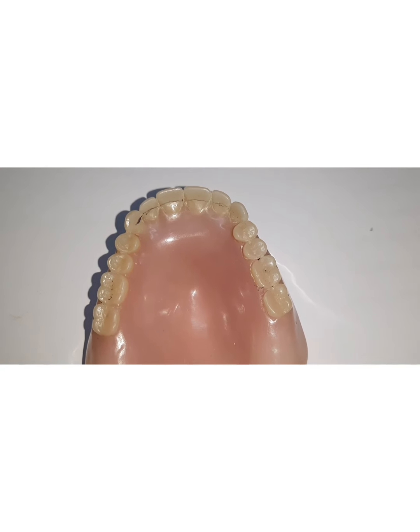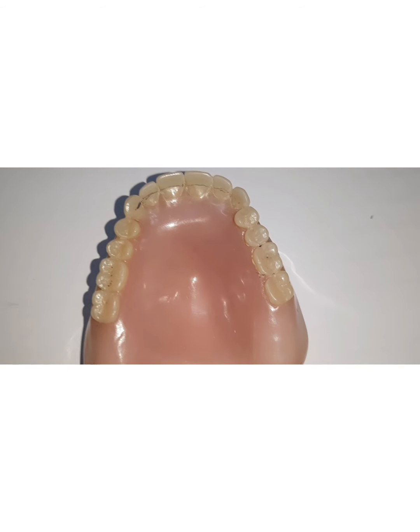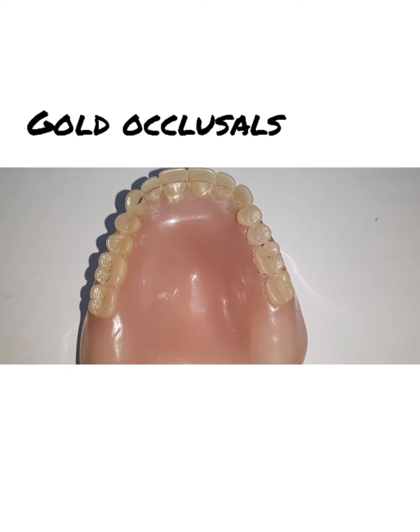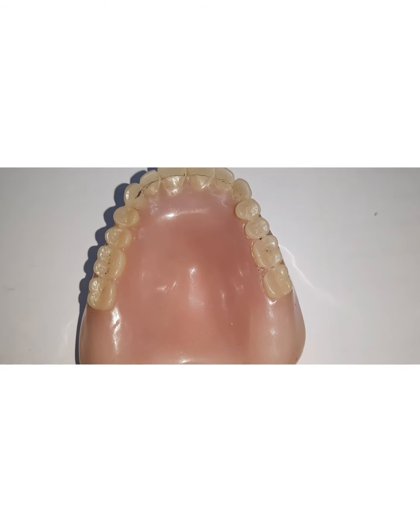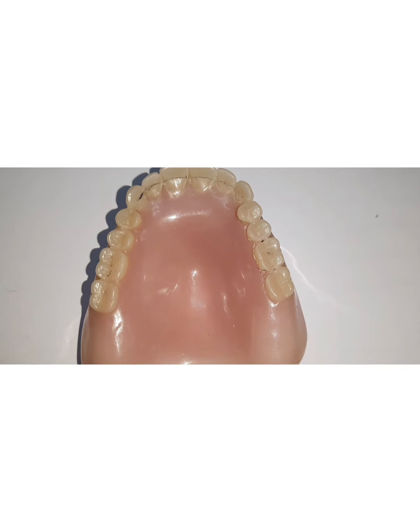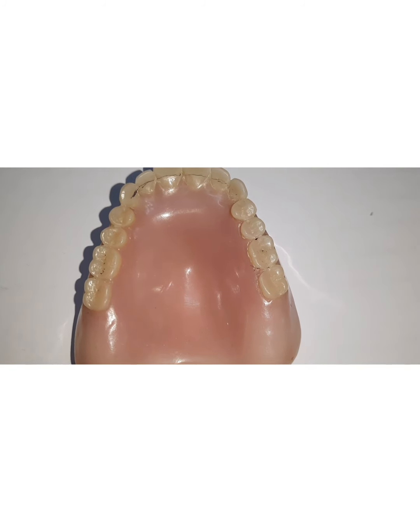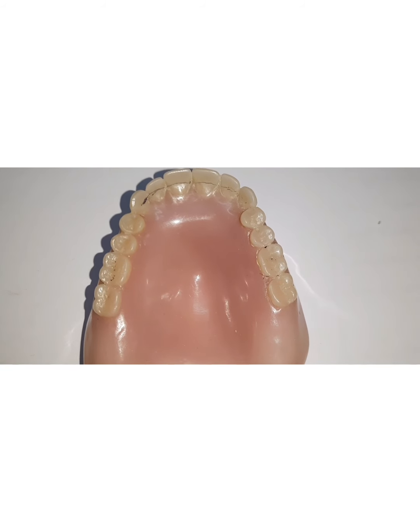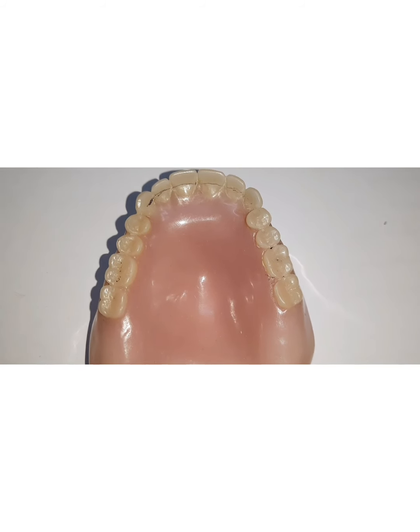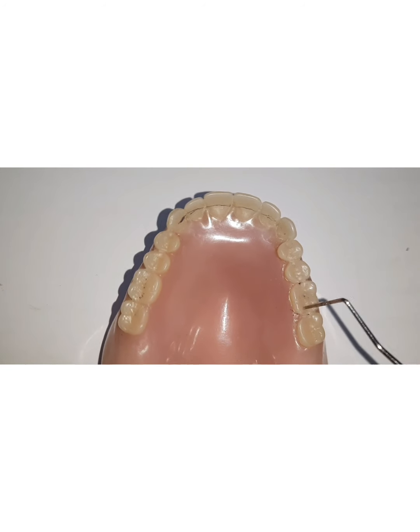Another type of teeth which can be used are the gold occlusals. Gold is considered the best material to oppose natural dentition, natural enamel, and the drawback here is that they are very expensive and require a longer fabrication time, and that is the reason they are not that popular. Apart from this, you have acrylic resin with amalgam stops. Basically, we will restore the occlusal surface with amalgam.